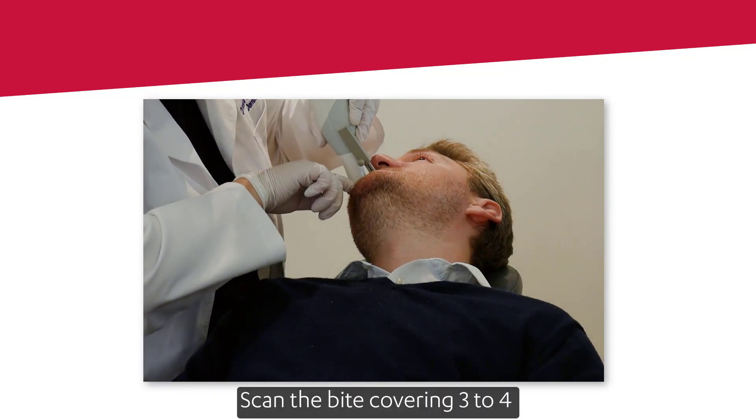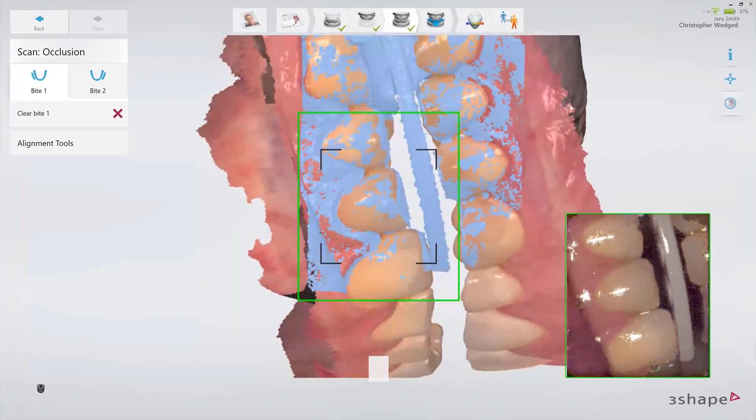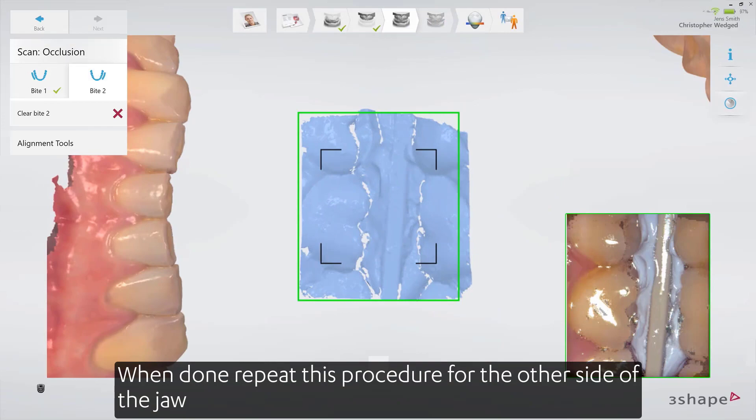Scan the bite, covering 3 to 4 teeth. When done, repeat this procedure for the other side of the jaw.